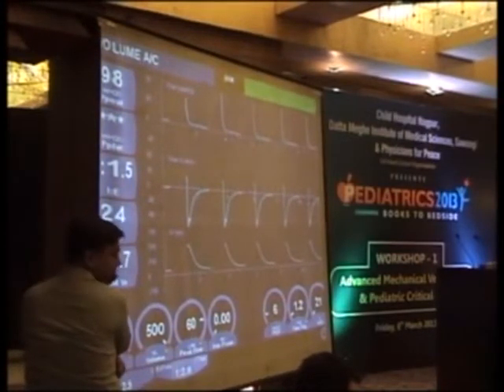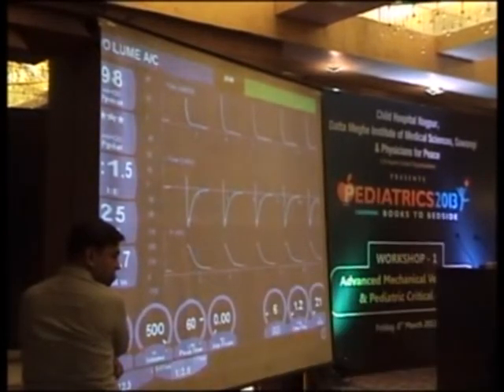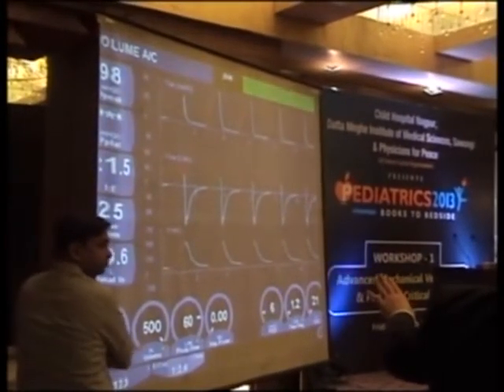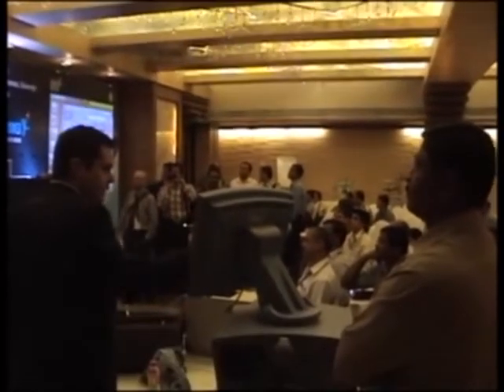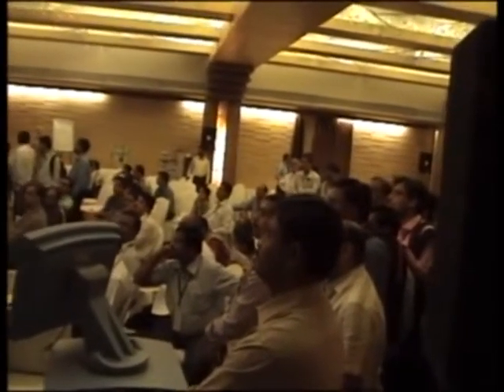Bear with me just one moment. Okay. So this 12-year-old girl, you can see airway graphics here. Oh, is it still doing it? Yeah. So we're being supported with a respiratory rate of 25. Tidal volume is 500. And let's see what our weight is real quick here. Yeah, so that's a 50-kilo kid, big kid. And we are receiving volume ventilation.